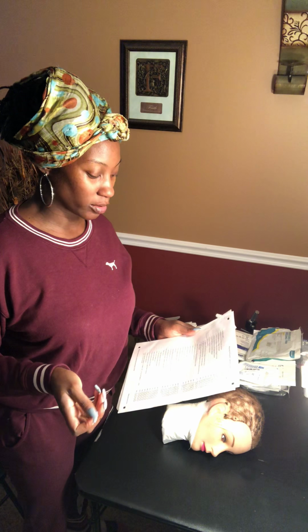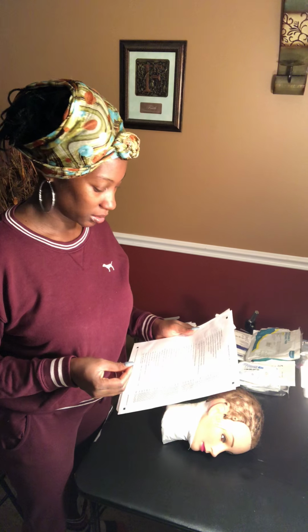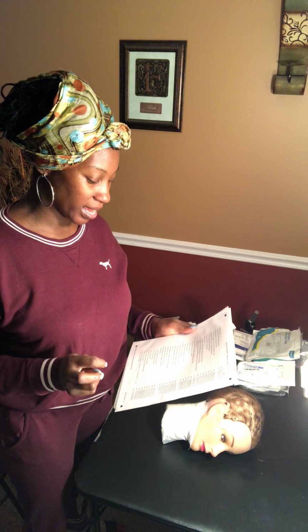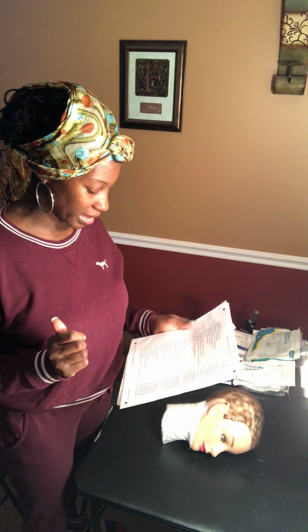F, apply sterile dressing without contaminating the wound. G, cover packed wound with a sterile 4x4. H, cover 4x4 with sterile ABD pad. I, secure the dressing. J, label dressing with the date, time, and initials. So that's what you're expected to do.